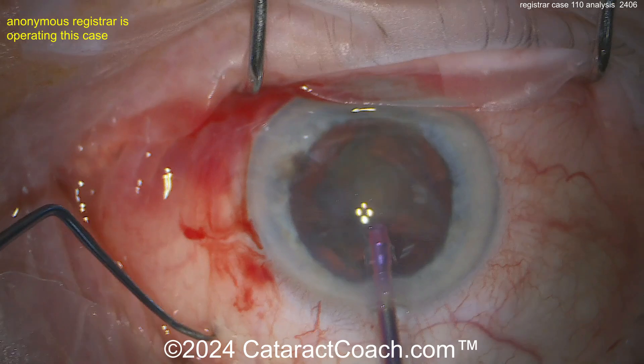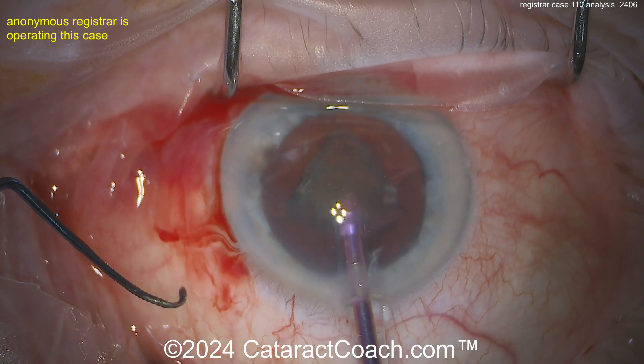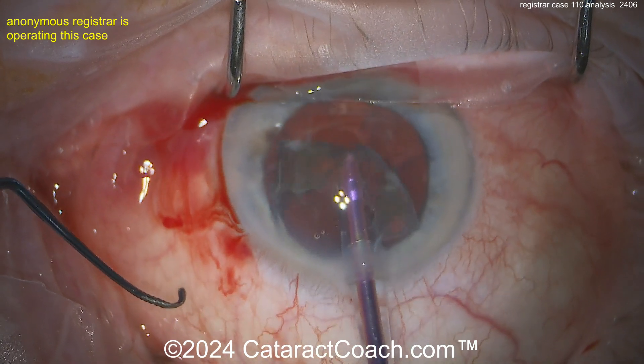You're taking the chopper out of the eye because you have unstable fluidics, but there's a better way. Instead of taking the chopper out, I like to keep the chopper in the eye to help protect the posterior capsule. But you did have unstable fluidics — go back and watch that again.